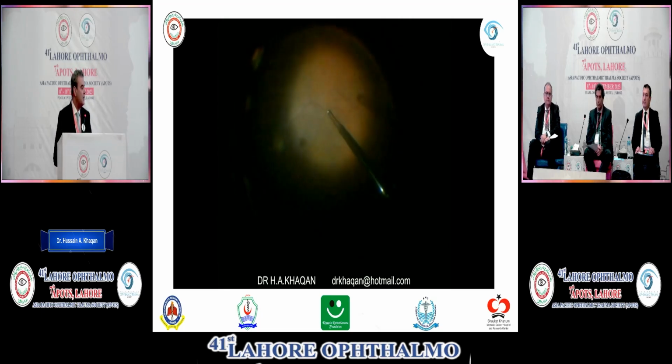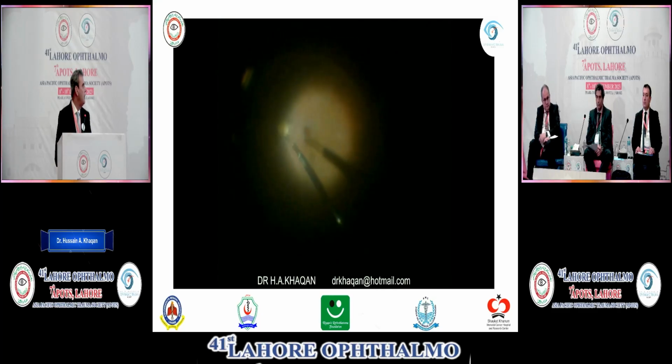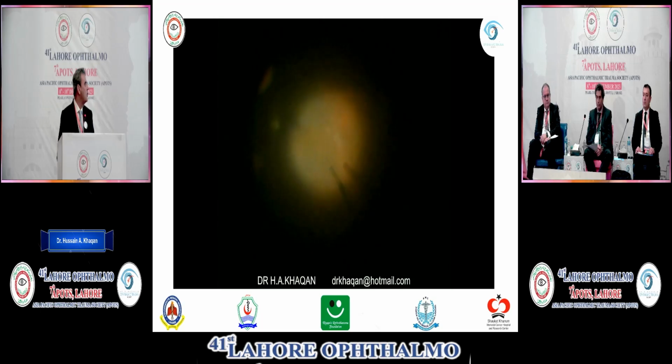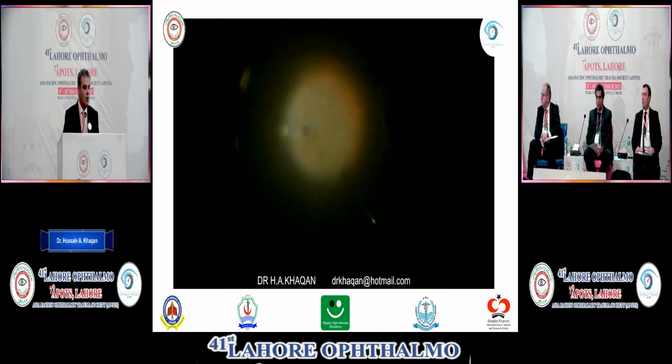So I injected the brilliant blue, and I'm just showing you the surgeon did a great job. He didn't do anything wrong the first time. He did peel the ILM. I am just showing you the arcade to arcade that there is no stain. It's not very clear. Can you switch off the lights, please? So here you can see he did a large ILM peel in this hole, but it didn't close.